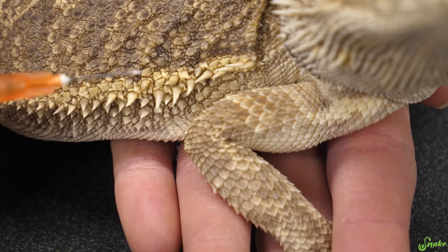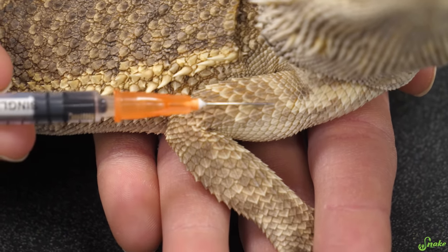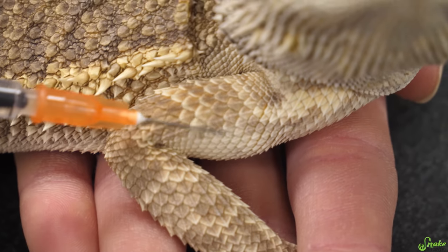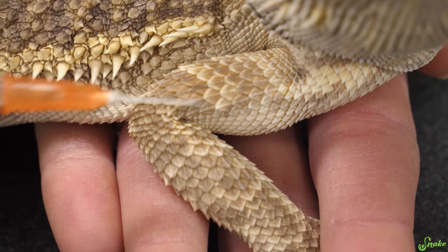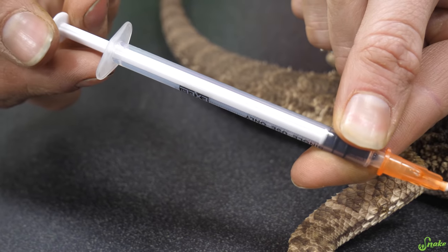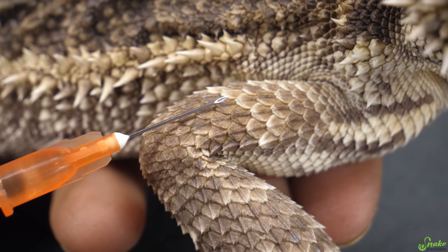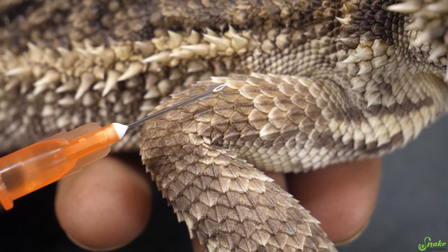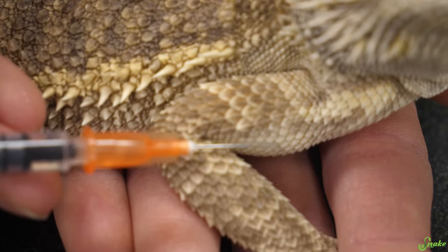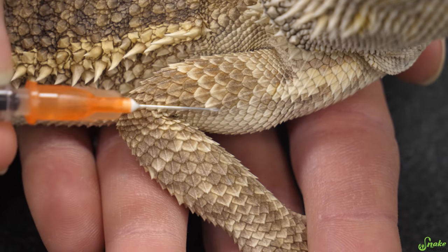When you're pushing the needle in, you want to aim for around the middle of the muscle. You obviously don't want to push it all the way into the leg itself — you don't want it poking out the other end on a small bearded dragon or small lizard. So you want it to go into the middle of that muscle. Once the needle is in, pull back slightly on the plunger, and if you see any blood getting sucked back into the syringe, that means you hit a vein. You don't want to inject this into a vein. So if that happens, just pull the needle out and try again in a different spot. The chances of hitting a vein are very slim, but it's still a good idea to pull back on that plunger just to make sure.